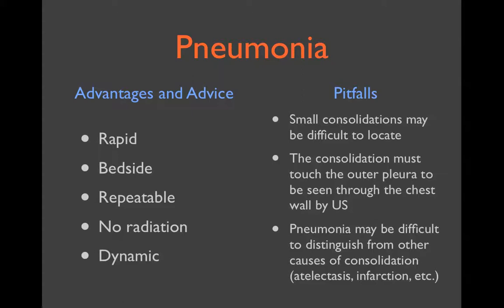In summary, using point-of-care ultrasound to detect pneumonia is a rapid and relatively simple exam that can be performed at the bedside in any setting. It is repeatable and has been described as being used to monitor the resolution and re-aeration of lung consolidations. There is no radiation involved, and it's a dynamic exam that the clinician can direct to address the patient's and his or her own needs and interests.